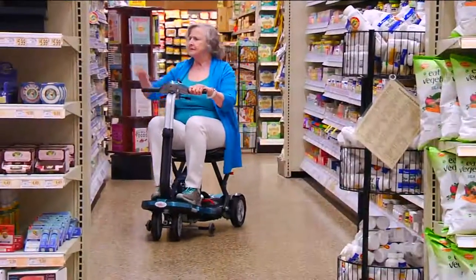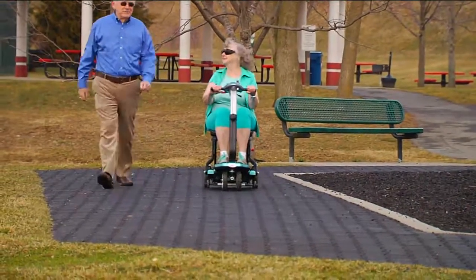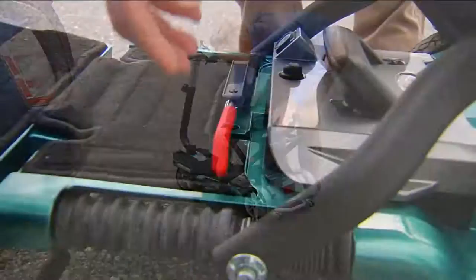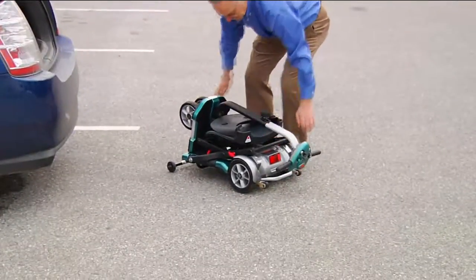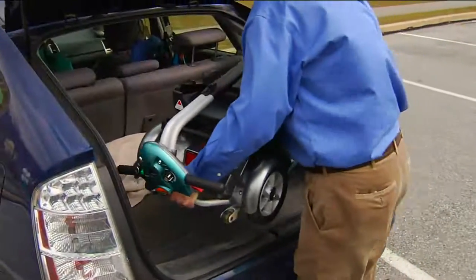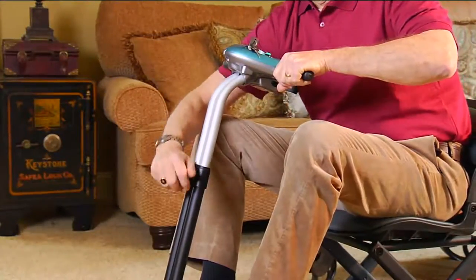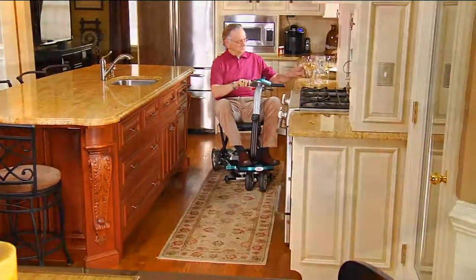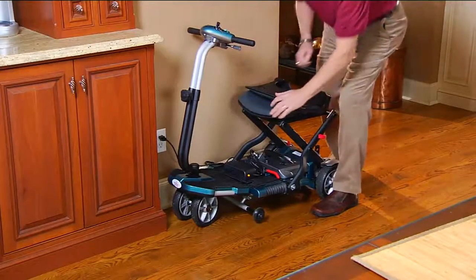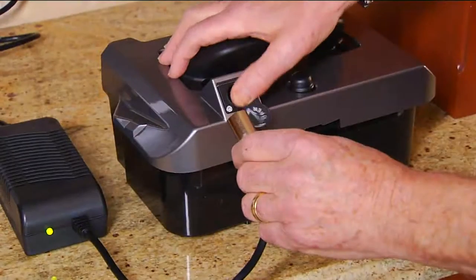Even in food stores, maneuverability around other people with shopping carts and through tighter aisles can be difficult, but this can do that. What I like too is if you're using your own cart in a grocery store, it's your own cart — you don't have to worry about who sat on it before you. Around the holidays, when mom or dad doesn't want to go to the kids' soccer games or football games because they feel they're going to hold everybody back — this gets them out there.